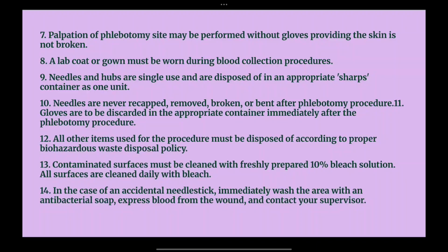So it is essential to properly segregate the waste that you are discarding after single use. It is important to know whichever color codes are required. I'll be covering another video for biohazard waste management, where I'll let you know the color codes for each and every waste disposable.